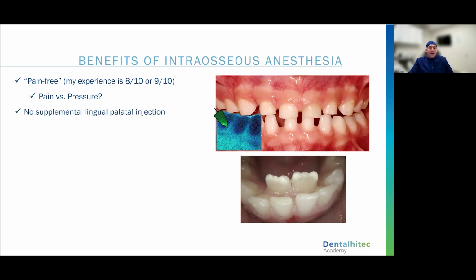Not having to give multiple injections in a site is one of the greatest things ever. You look at those lower anterior teeth, if I can give one easy intraosseous injection right at the midline there between O and P, and that's it. It's faster, it's less stressful for my patient and my parents, and everybody's happy at the end of the day.